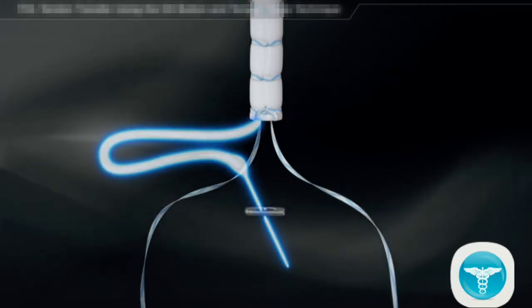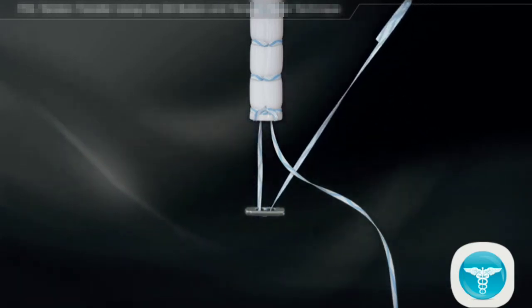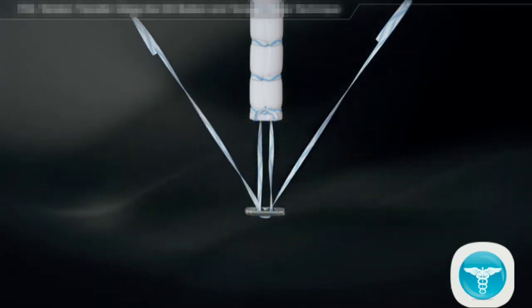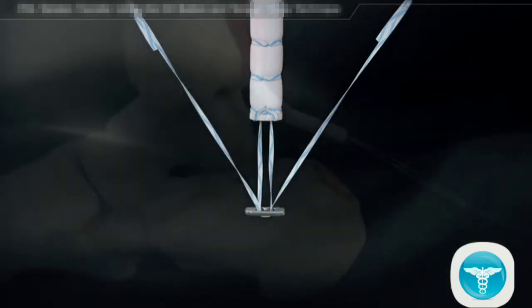Thread one suture limb from the tendon whip stitch through one side of the 12 mm DX button and back through the opposite side with a straight needle. Thread the other suture limb through in the same manner, starting on the opposite side as the first limb. Make sure the suture limbs are not tangled, pulling each limb to ensure the button slides freely.